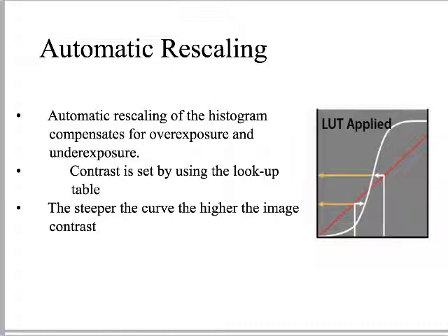If you're given a picture on your registry and they're asking you to look up grayscale and to consider it from the point of view of the H&D curve, or this S-shaped curve, the whole game is contrast. We might ask, how so? It is very, very simple.